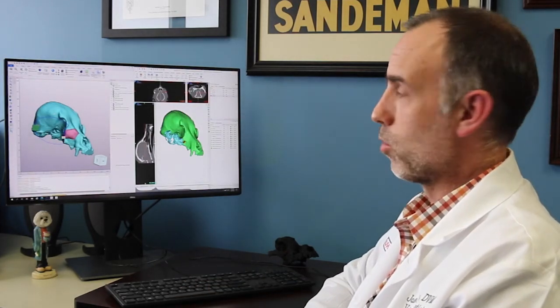And over to the left is a software that's associated with this design software that allows us to create a surgical guide. Now, these surgical guides can then be printed on a 3D printer and used in the surgery to make very precise cuts.